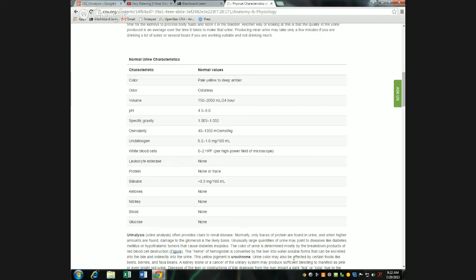So after you've put the dipstick in your undiluted sample, if it isn't 12 milliliters, bring it up to 12 milliliters with water so that it will balance. And then everybody takes their tube back here, and I'll spin it around.